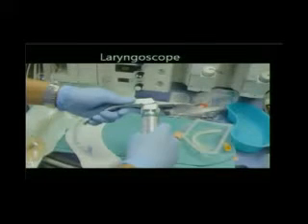An oral airway, which will just pick the tongue up in case the tongue falls to the back of the throat and blocks the movement of air. If that doesn't work, there's something that goes through the nose. Again, it's to go past the tongue so that air can get past the tongue into the windpipe. But if that should fail for some reason, then we may actually have to look inside the throat. And if you're going to look inside the throat, this is the instrument we use, the laryngoscope.